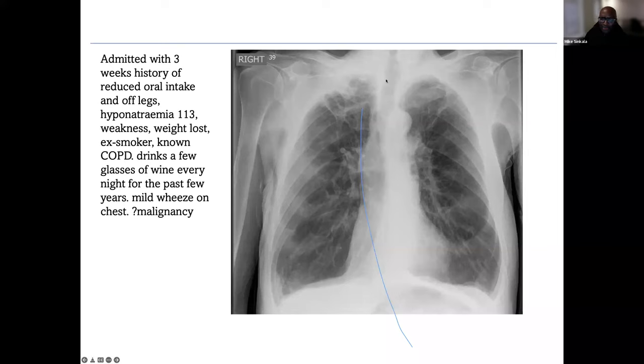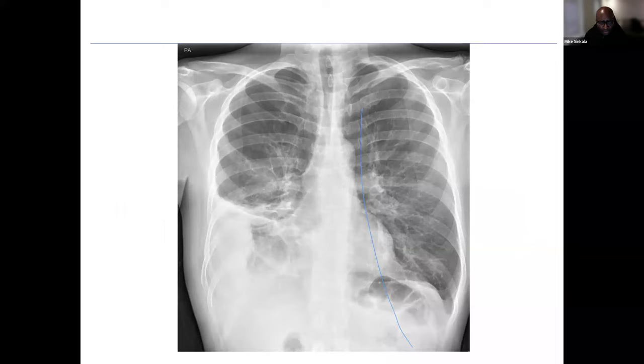And we do have some kind of infection or lung scarring in the upper lobe of the right lung here. So again, this one, I think it's just a mass here, possibly with basal atelectasis here.